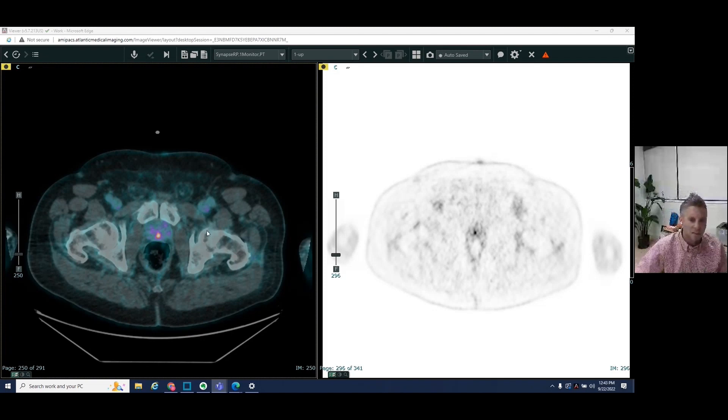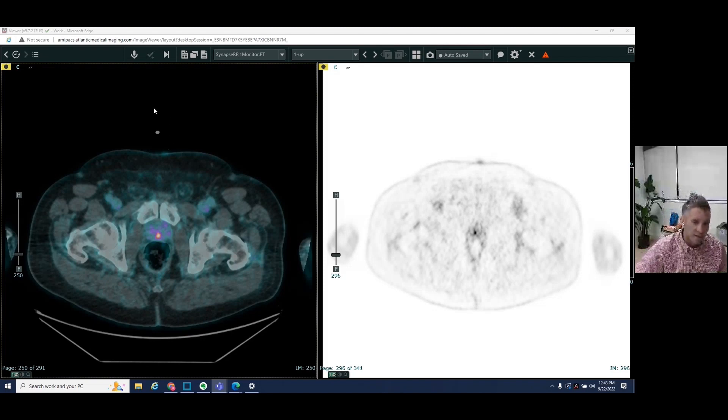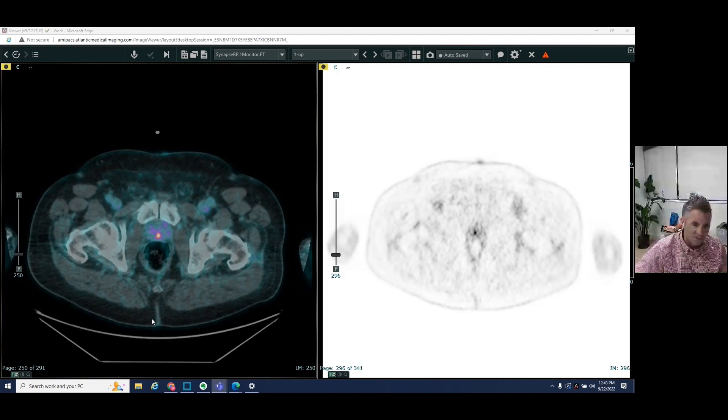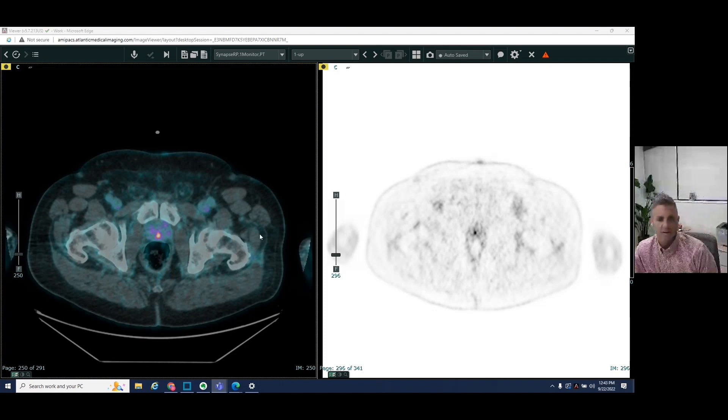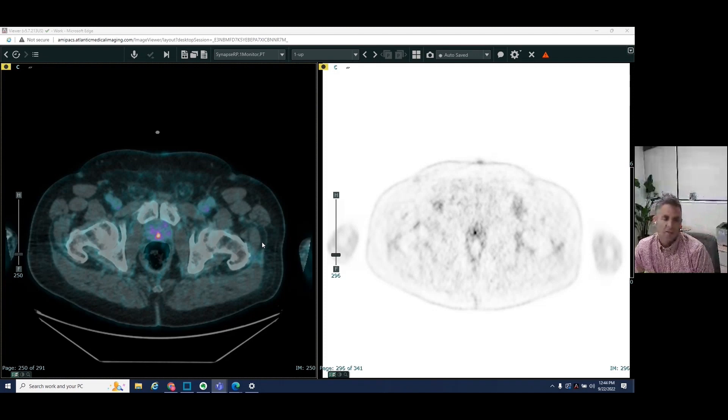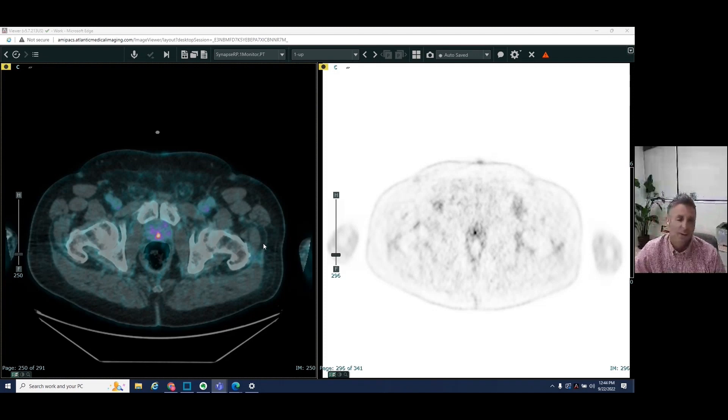And so let's take a look. So patient is lying down. This is anterior or the patient's front. This is posterior, the patient's back, right side, left side. And we're looking for areas which are lighting up.